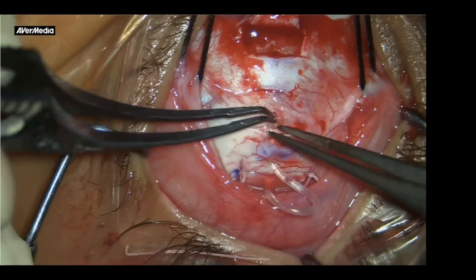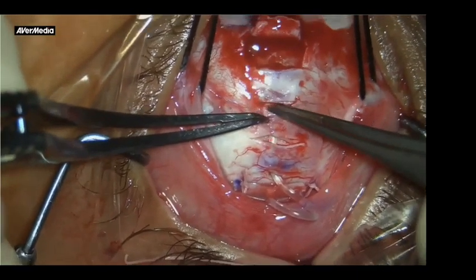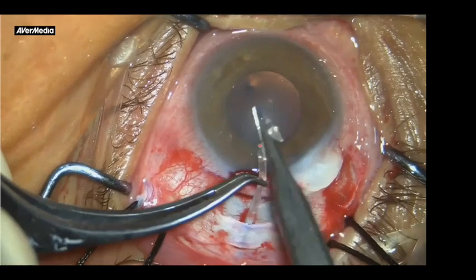And then once you get it, you will push it into the second tunnel. So it's again, just connected. They are all connected together. And then once you have this appearance, then you will cut the extra length of the tube.